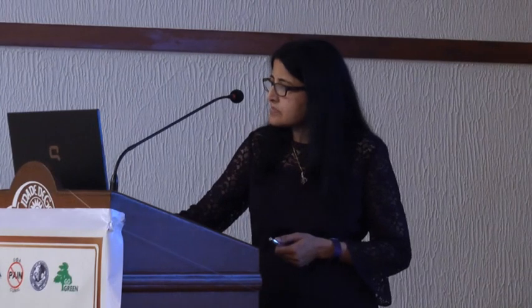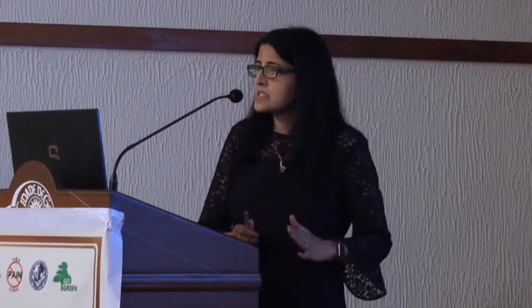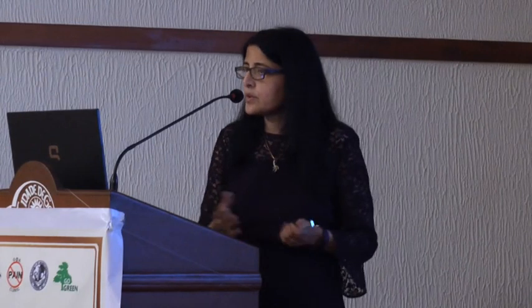It targets the roots, mostly the upper roots, C5, C6, and sometimes you can catch C7 as well. Again, all the several factors, the patient position, block at similar sort of position to the supraclavicular. So I have the patient semi-sat up, head turned to the other side. You can move the pillow out of the way, or you can use the head hang.